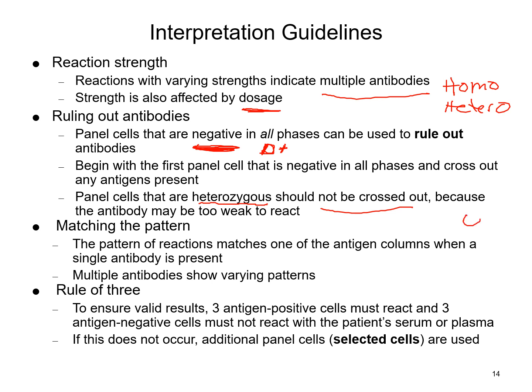Remember, when you've got those heterozygous cells, you don't have as many copies of that particular antigen present on those cells, so you can have a weaker reactivity due to weaker expression. Could be a newly forming antibody, one that's not been stimulated in a while, so it's weaker. So there are a variety of things that can cause those weaker reactions.